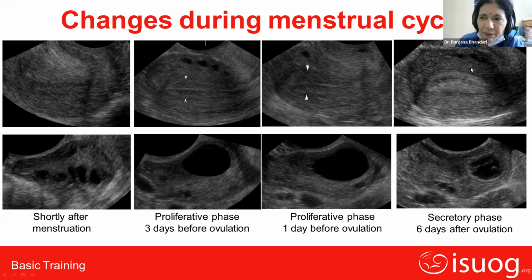So this is the hyperechoic endometrium. This also shows a ring sign because the increased density starts from the basal layer. So see, there is a thin, ring-like structure, which is also seen in cases of the secretory phase. Also, see, over here there was no enhancement behind the posterior part of the endometrium, but over here you are seeing enhancement behind the posterior part. This is because of the tortuous vessels. The tortuous vessels are causing enhancement posterior to the endometrium.